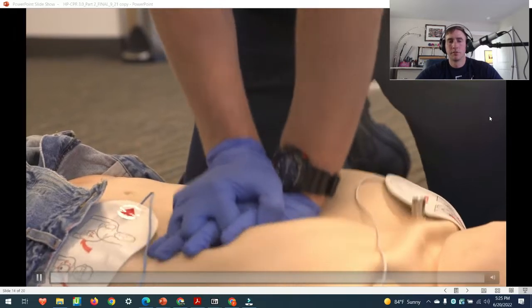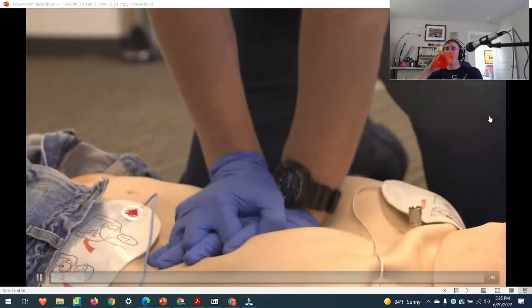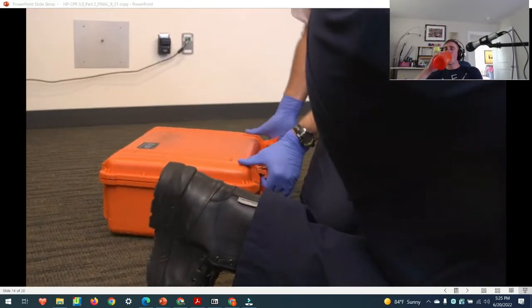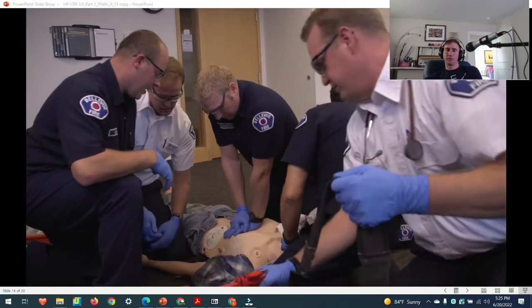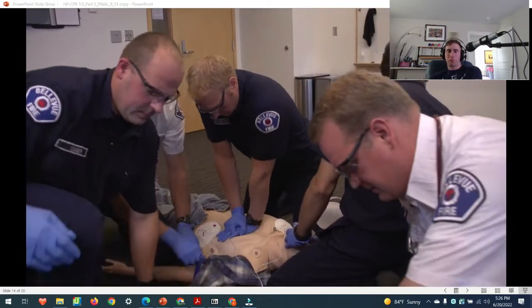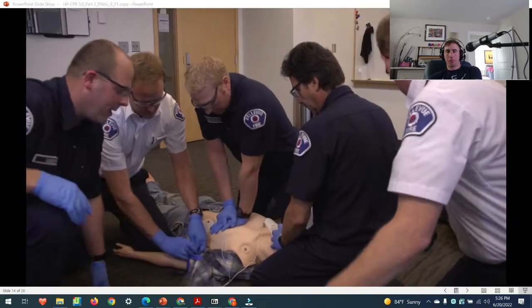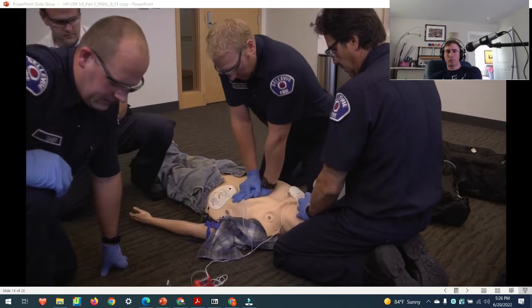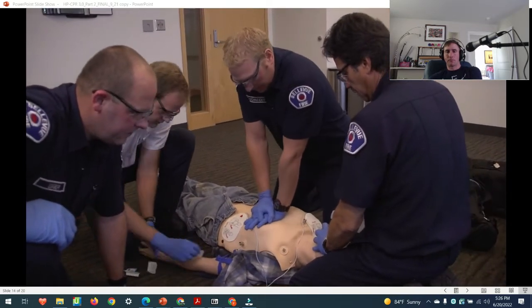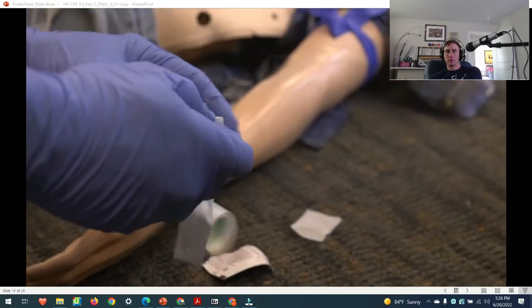26, 27, 28, 29, 30. Just ventilations. Matt, how's it going? Good. What you guys at? 28, 29, 30. One more respiration round. Good ventilation. We're gonna swap out so we can analyze. After this respiration, Mario, you hop out. 28, 29, 30. Okay, and continue with compressions. After this cycle, we'll analyze.